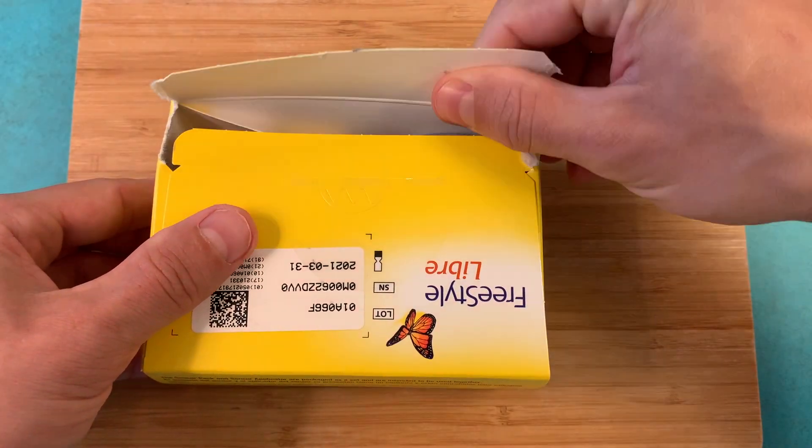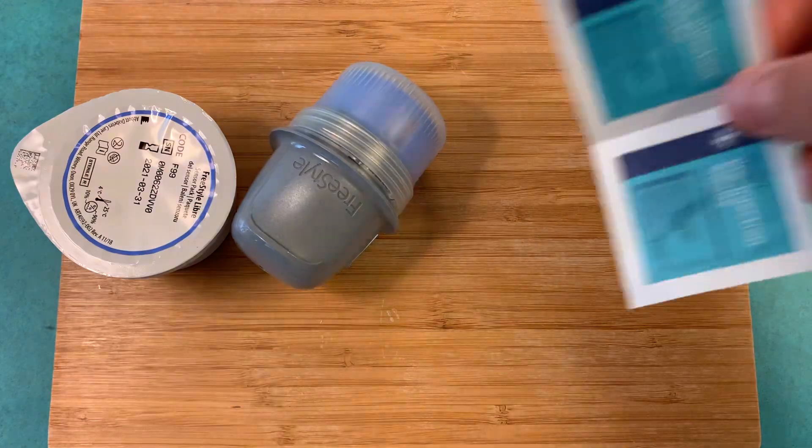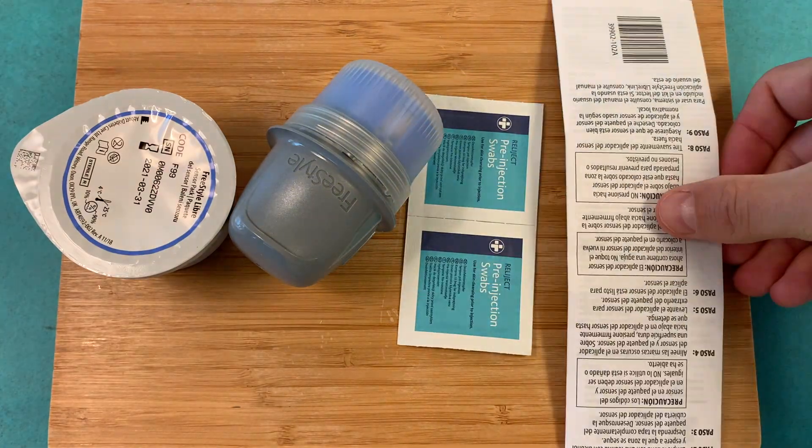When you open this yellow box you will find a sensor pack, sensor applicator, alcohol wipes, and product insert. Take them out and put them all on the table.